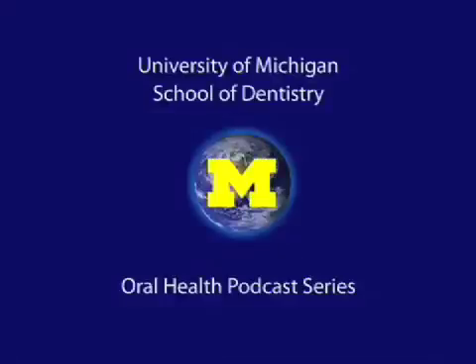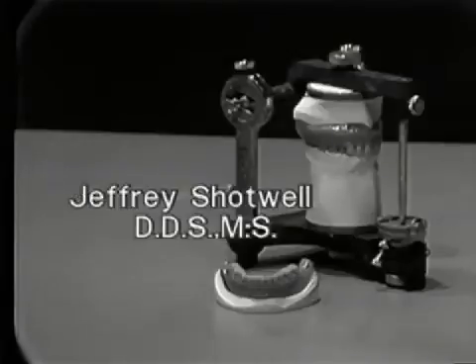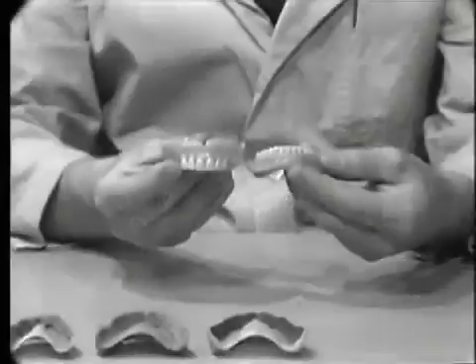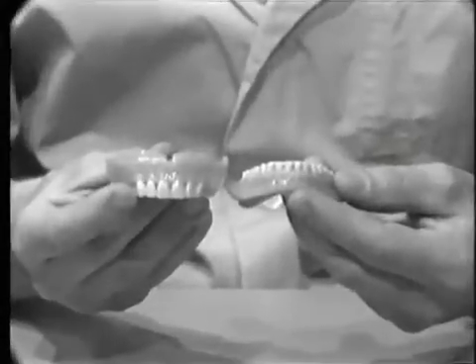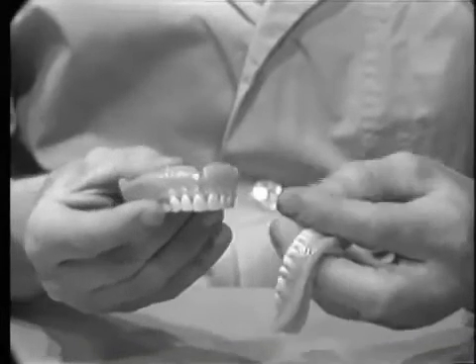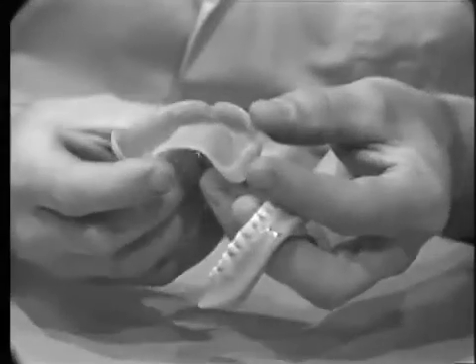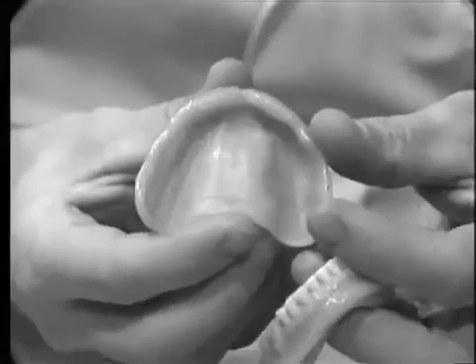Welcome to the University of Michigan Dentistry Podcast Series, promoting oral health care worldwide. The patient remount procedure is the final step in eliminating occlusal discrepancies prior to the delivery of the dentures. The procedure to follow will illustrate the fabrication of the type of cast to be used in the patient remount.